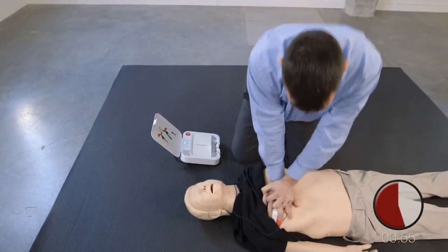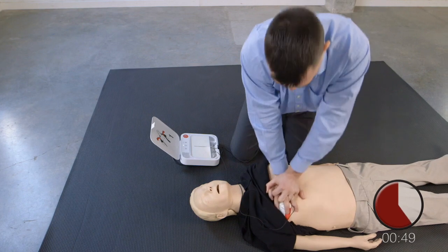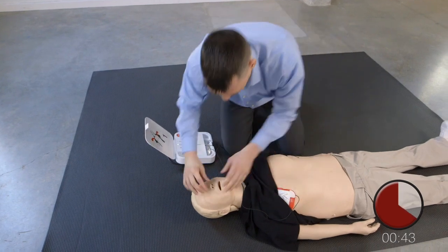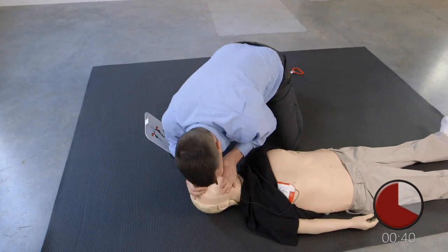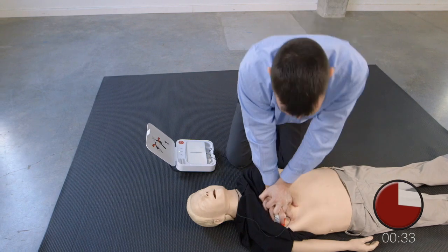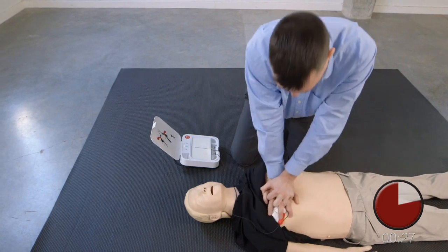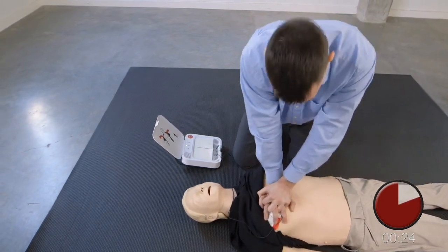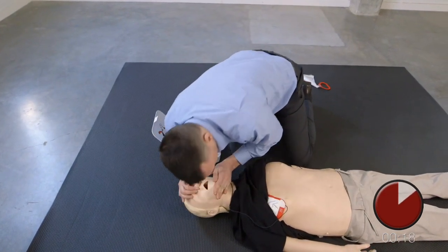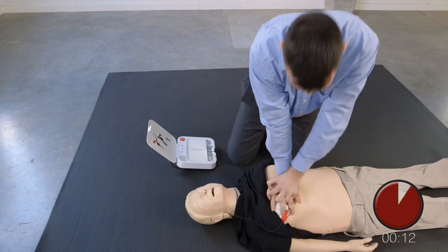Tryck ner hårt minst fem centimeter. En. Gör två inblåsningar. En. Två. Återuppta bröstkompressionerna. Tryck ner hårt minst fem centimeter. Gör två inblåsningar. En. Två. Återuppta bröstkompressionerna. Tryck ner hårt minst fem centimeter.